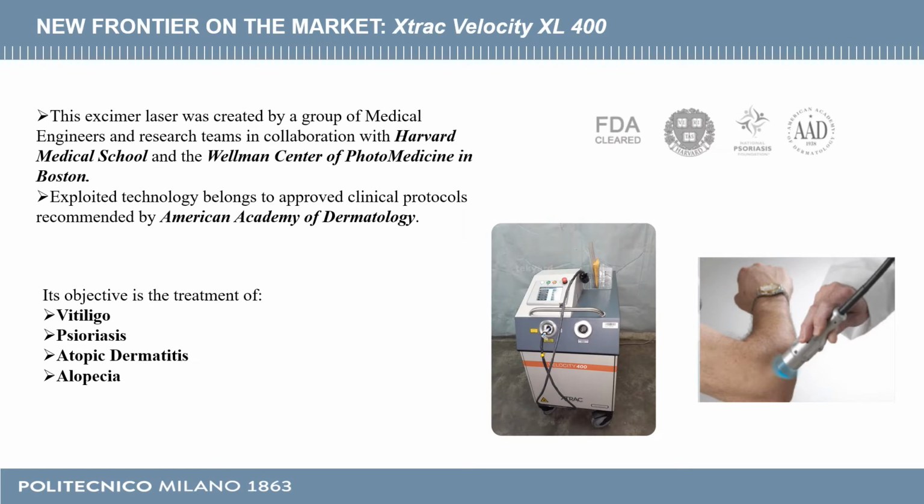Now, in particular, we can focus on the 308 nanometer excimer laser, which has been in particular approved by the Food and Drug Administration for the treatment of pathologies like psoriasis and vitiligo. Effectively, the ability to treat localized areas has led to many studies that have determined its potential in the treatment of focal diseases that are related to inflammation or hypopigmentation.